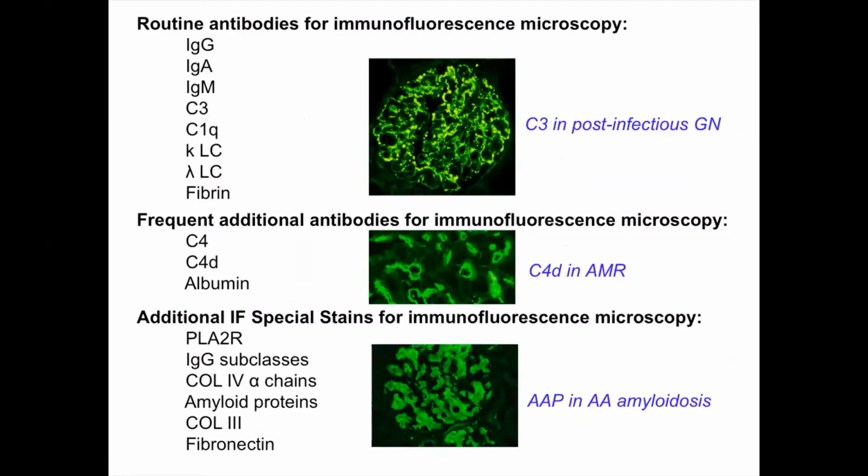فهذا كله مراجعة. إنزين الحين بالنسبة حق الimmunofluorescence، عندنا an essential panel تتكون من immunoglobulins, complements and light chains. فالimmunoglobulins أو heavy chains are IgG, IgA, IgM.